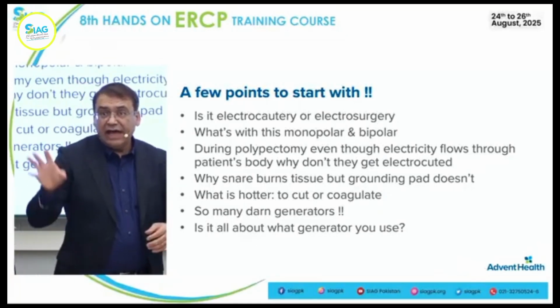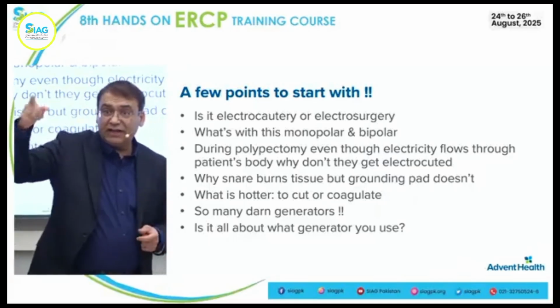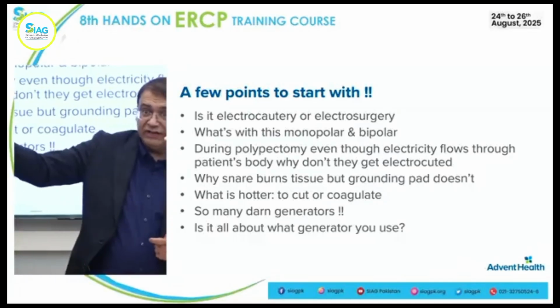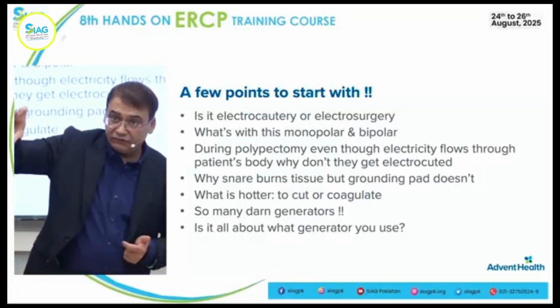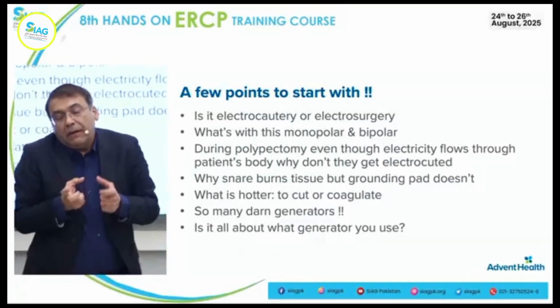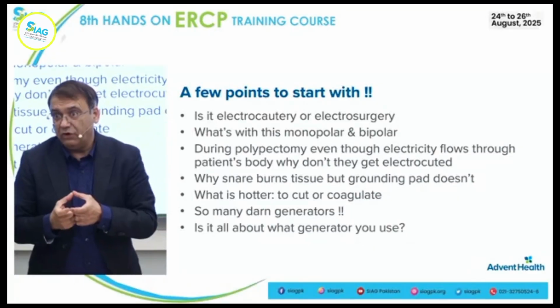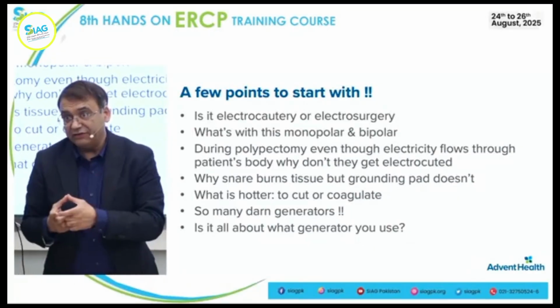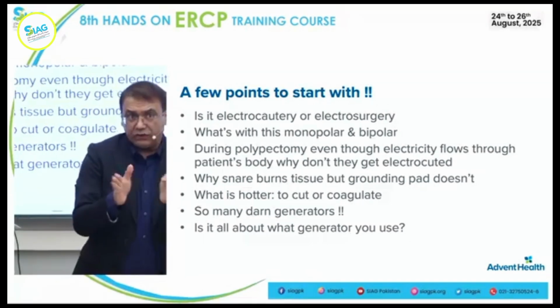So that's endocut I and Q. I don't know what that is. Yeah. Q looks like a snare, maybe we use it for snare. I looks like a needle, that's why we use it for that. Like even in the sphincterotomy, it looks like a needle. But the settings which are used, only ERBE engineers know. Nobody else does. They just keep it a secret.